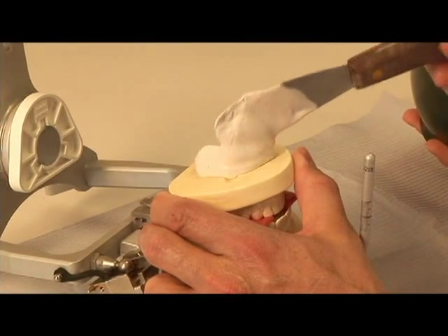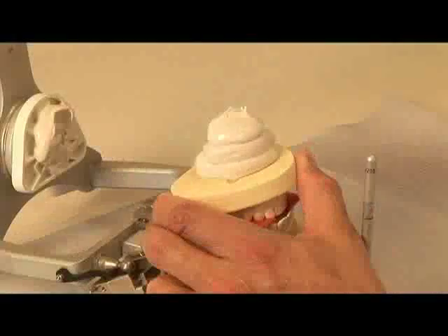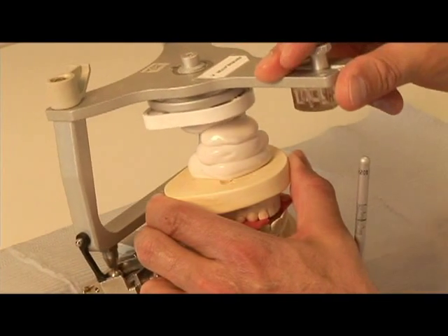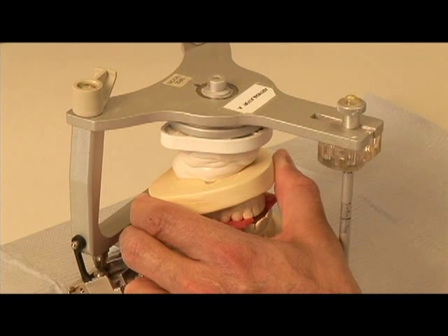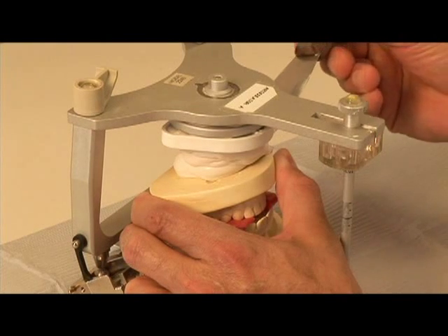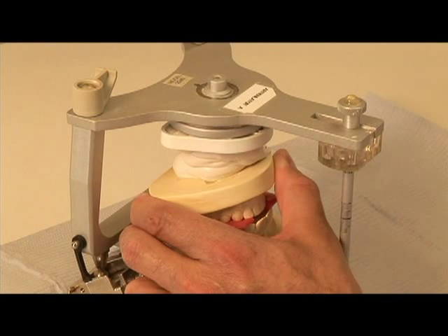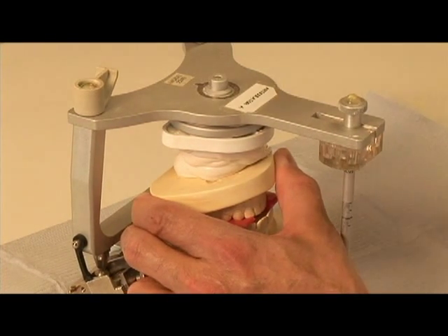Mount the mandibular cast in the same fashion as the maxillary cast was mounted. When closing the mandibular member, again verify that there is full seat in the condylar elements and that the end of the incisal guide pin is touching the plastic incisal guide table. Allow the mounting stone to set. It is not necessary to overfill the area on top of the cast with stone, as this will be added to at a later time once the mounting has been verified.